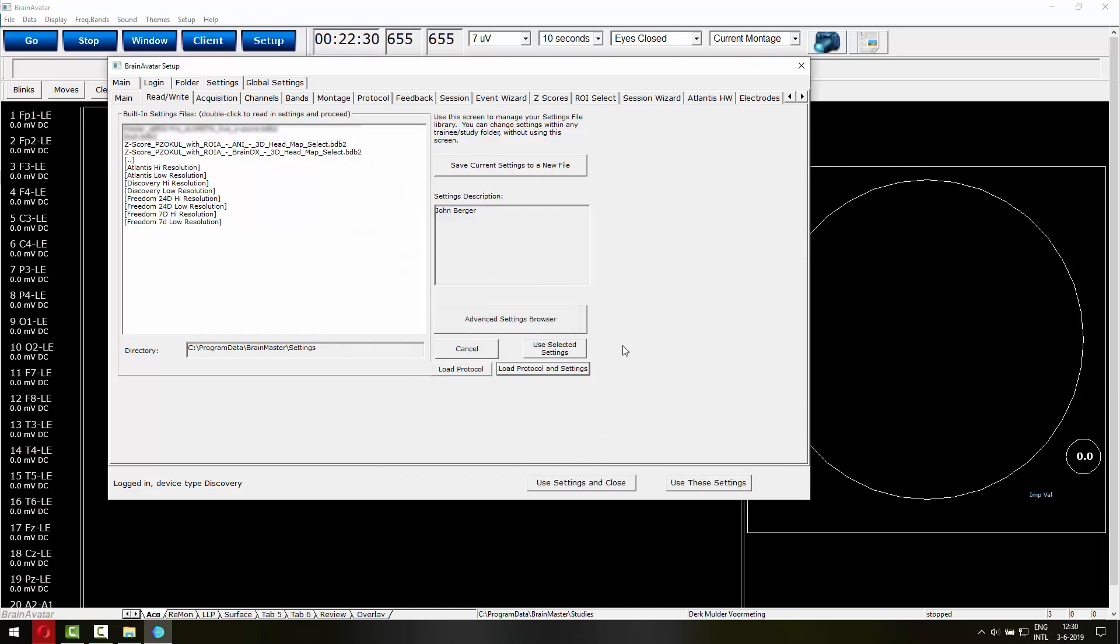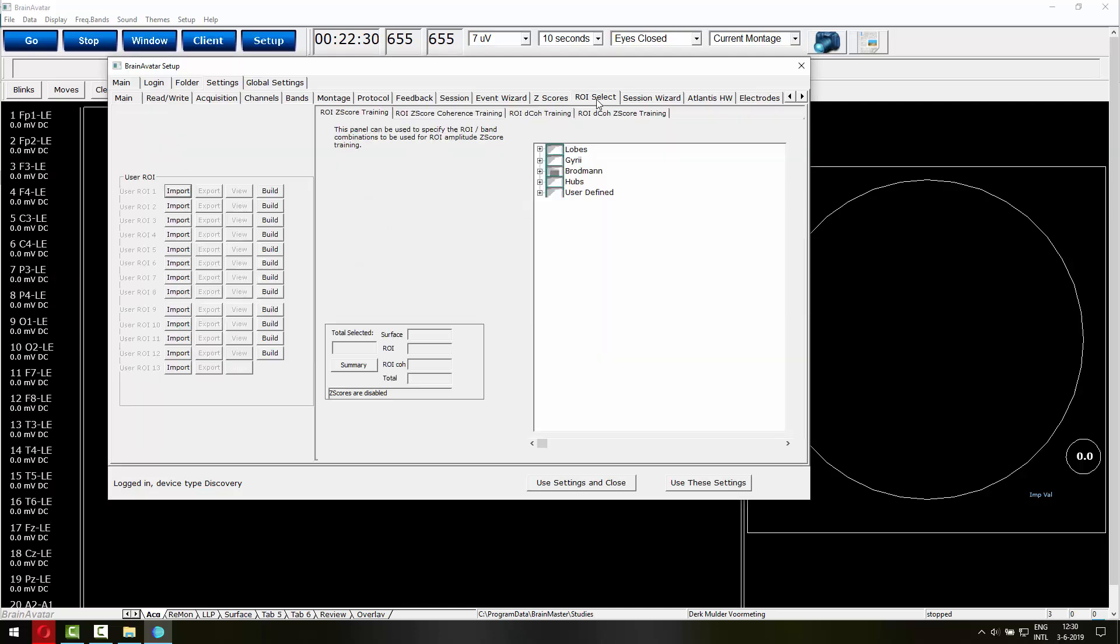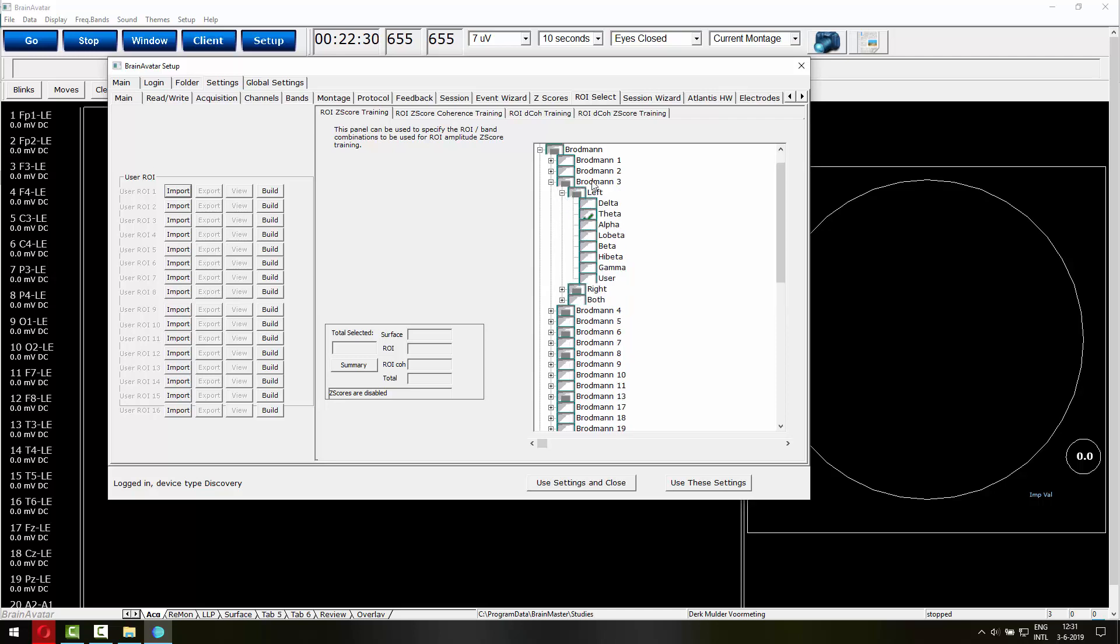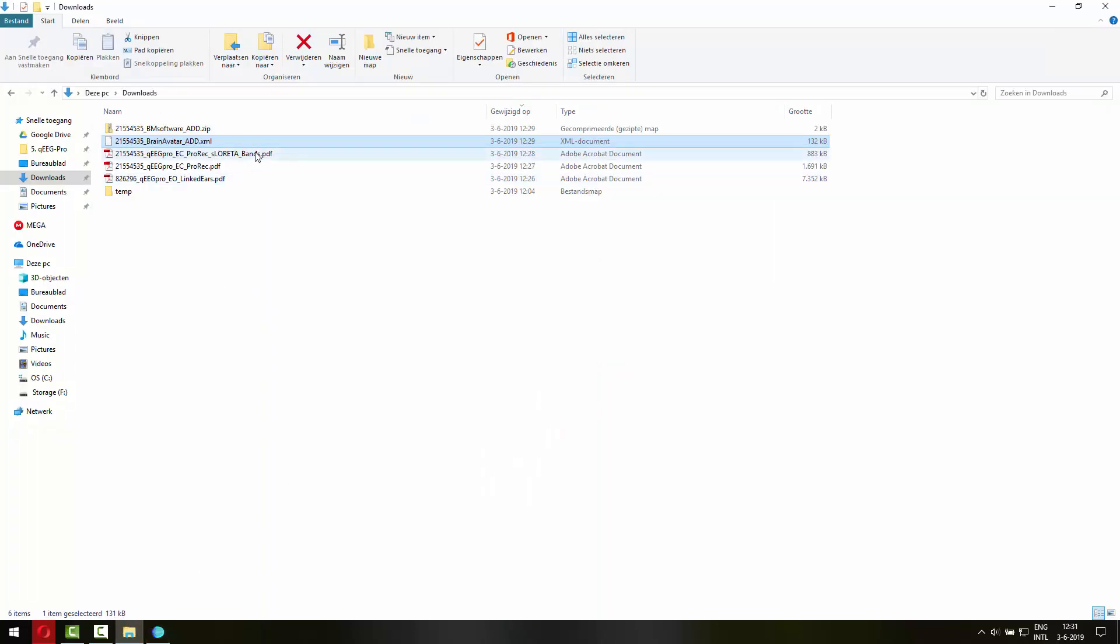And if I now go to the ROI select, region of interest select, you can see that Broadman areas have been selected based on the XML file and based on the protocol recommendation done by QEEG Pro. So here you have all the different Broadman areas that are depicted in the report.